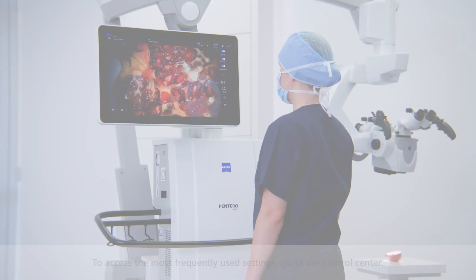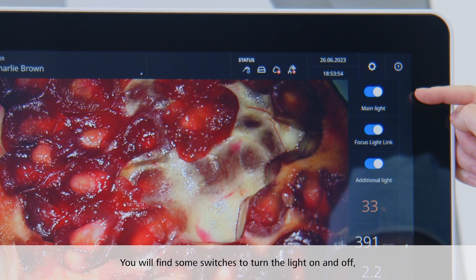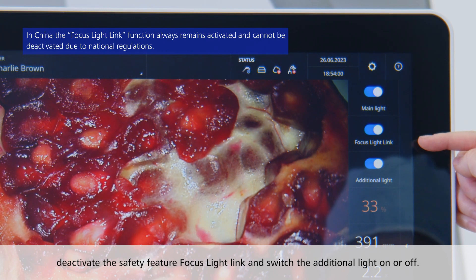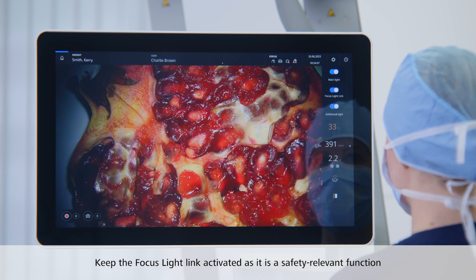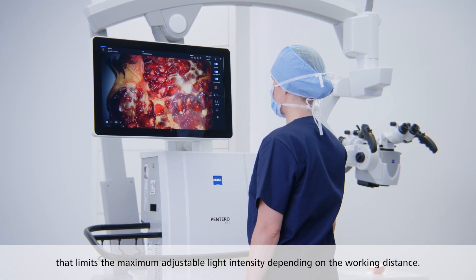To access the most frequently used settings, go to the control center on the right side of the touch screen. On top, you will find some switches to turn the light on and off, deactivate the safety feature focus light link, and switch the additional light on or off. We recommend keeping the focus light link activated, as it is a safety-relevant function that limits the maximum adjustable light intensity depending on the working distance.